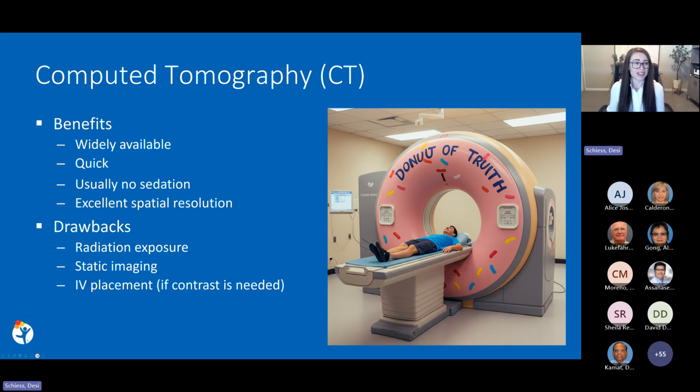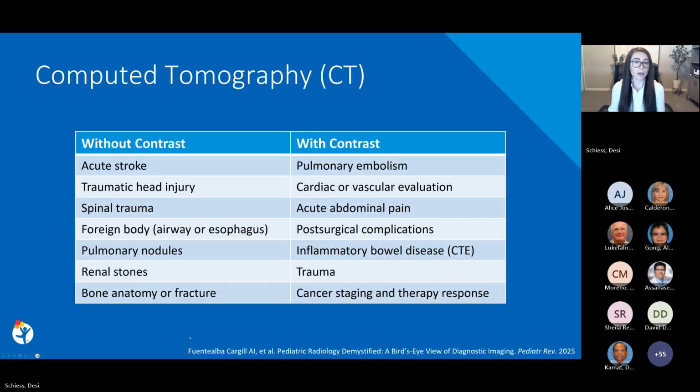So the benefits of CT are that it is widely available, quick, usually does not require sedation, and has excellent spatial resolution. Drawbacks include radiation exposure, imaging at a single time point, and IV catheter placement for contrast-enhanced CT exams. Most pediatric CT exams are limited to a single acquisition to minimize radiation. For this reason, CT is either performed with contrast or without contrast, not both.